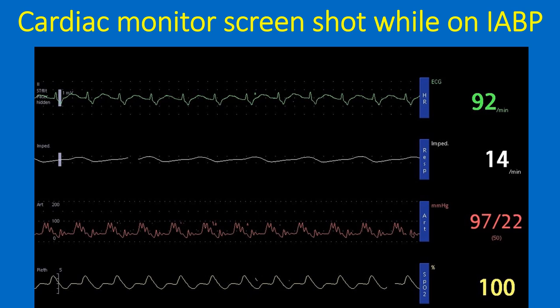On the cardiac monitor, the green, white, red, and yellow tracings are displayed, with readouts on the right side showing from top to bottom: heart rate, respiratory rate, blood pressure, and oxygen saturation. It can be seen that the pressure wave in systole is very small. A yellow marker is placed over the R wave on the ECG; the small pressure wave just after that is systolic, and the larger one following it represents diastolic augmentation by the IABP.